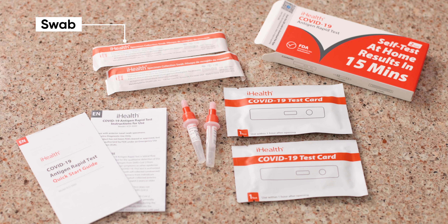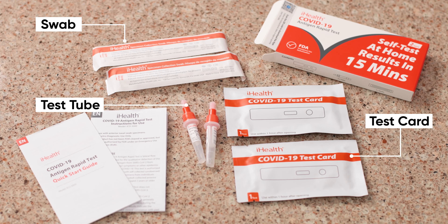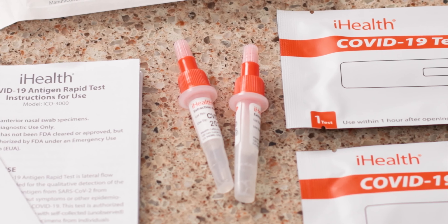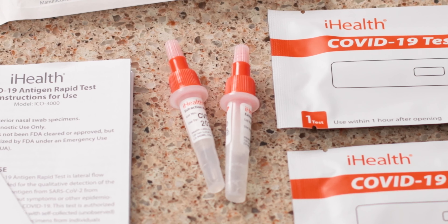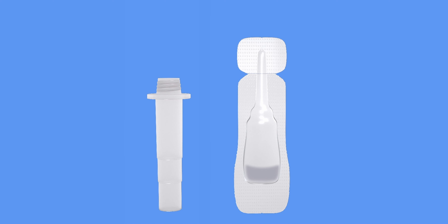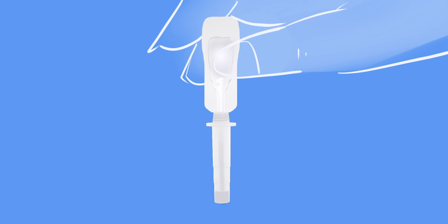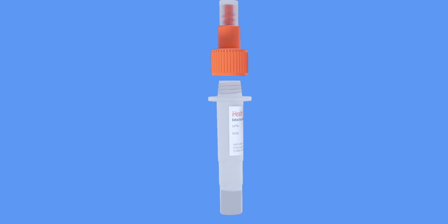In the box is a swab, a test card, and a test tube. Your test tube will likely have the testing solution already inside, but in some cases you may have received the solution in a separate packet. If so, no problem. Remove the larger lid and then carefully tear off the top portion of your solution packet. Pour the entire contents of the packet into the tube — careful not to spill. Now put the lid back on the tube and you're ready to go.